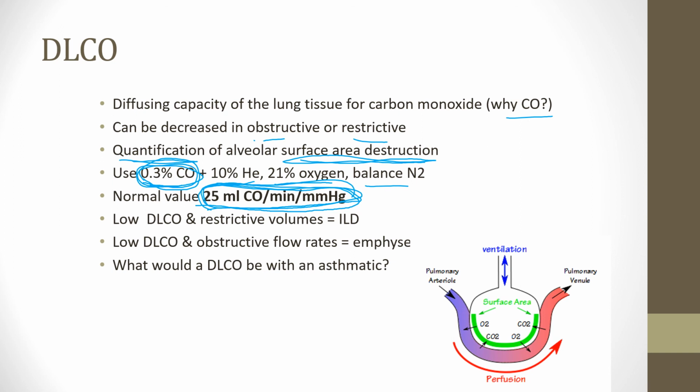All right. A low DLCO. So what does it mean? Why do I care? If the value is low, it could be a volume restriction, like an interstitial lung disease like pulmonary fibrosis is going on. So if I do a pulmonary function test, and I have low volumes and I have low DLCO, then that might be an interstitial lung disease of some sort. And there's over 200 different types of those, okay?